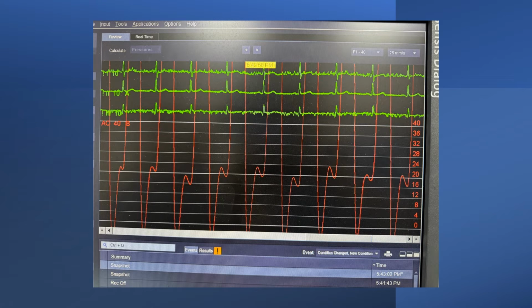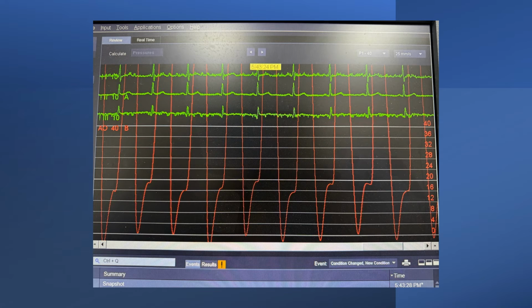The catheter used for LV angiography can be used to obtain information about hemodynamics, particularly the LVEDP. When we do that, proper measurement is done at 50 millimeters per second speed and a lower range of pressure measurement. Damping should be proper. This view shows underdamping with overshooting of the pressures. This can be corrected by injection of a small amount of diluted contrast.